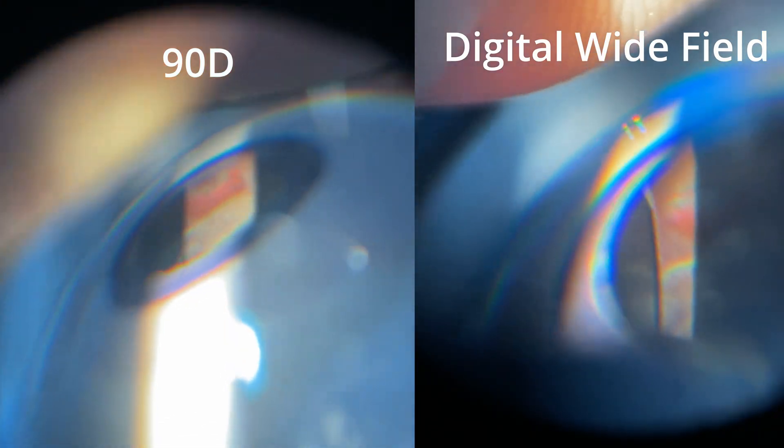Let me now show you a couple of videos of me examining the Pocket Retina. Here for example I'm showing you how far out in the periphery you can see with a 90D versus a digital wide field. Notice how much more of that tear you can see with the digital wide field. Watch my video on the different lens choices to learn more about that topic.